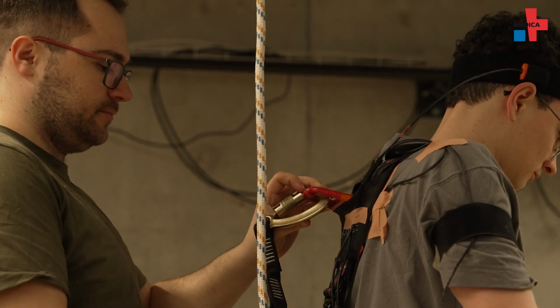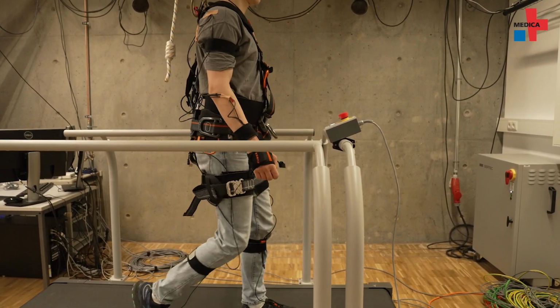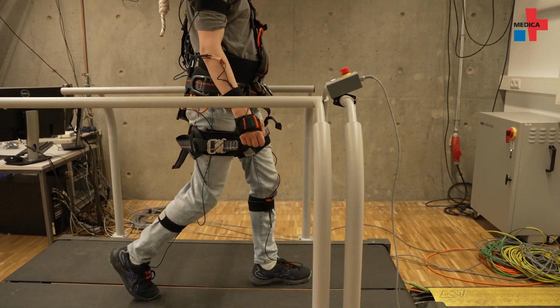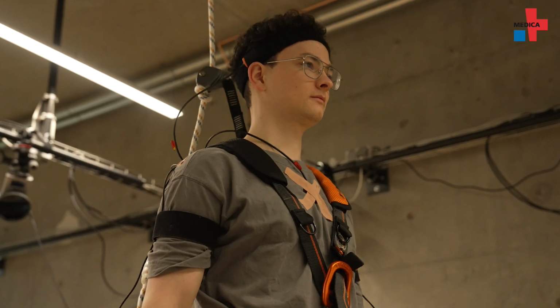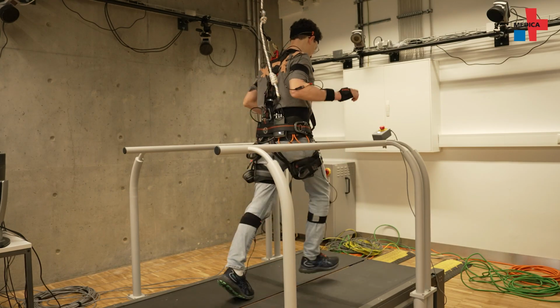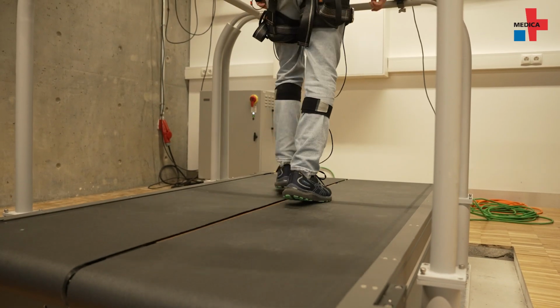The team wants to achieve these goals with the help of artificial intelligence, which can recognize conspicuous patterns from a large amount of movement data, sometimes even in real time. Tests and training sessions take place in the tripping course and on the treadmill. Dr. Annika Weber perhaps has the most fun of all, because she literally gets to watch her test subjects, who are of course well secured, stumble and learn how to catch themselves again.